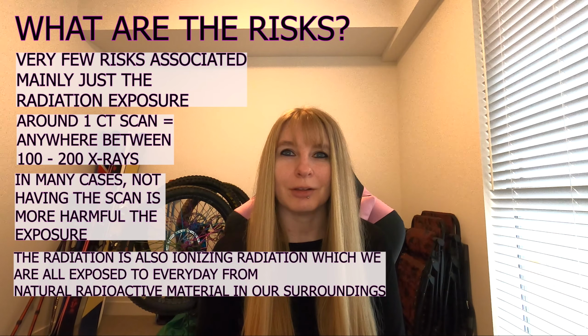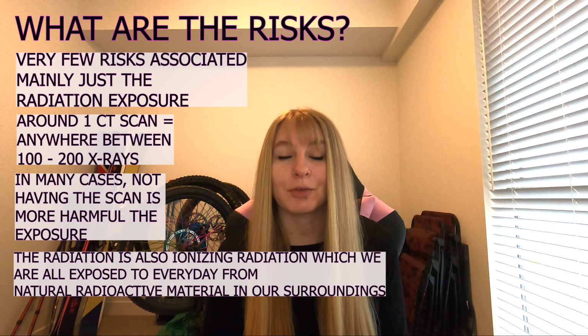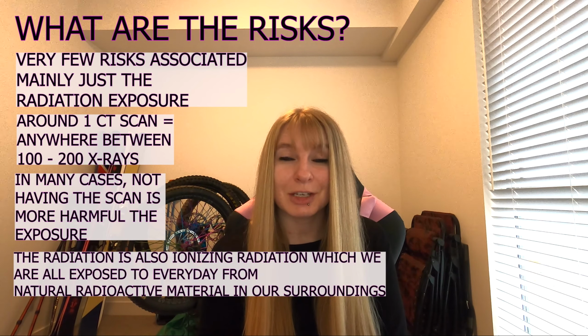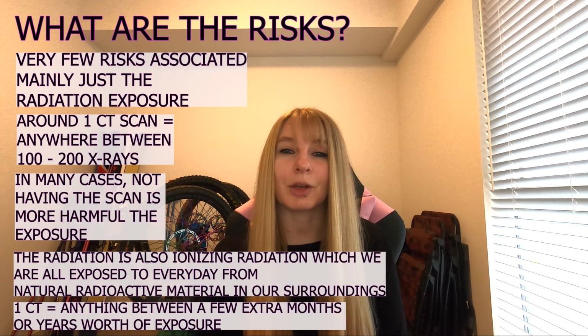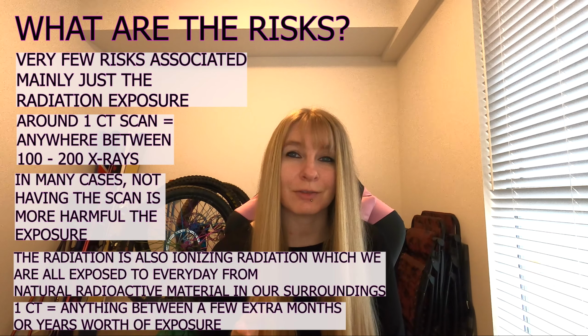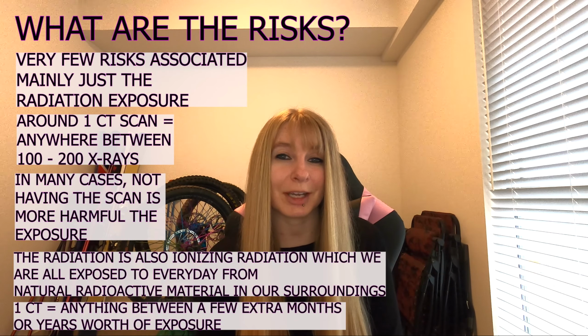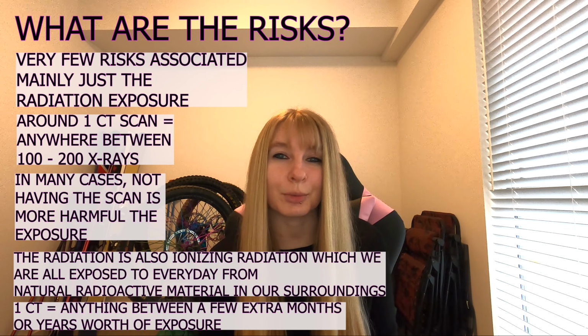The radiation as well is ionizing radiation, which we are all exposed to every single day from natural radioactive material in our surroundings. Again, one scan is said to be equivalent to anywhere between a few extra months or a few extra years of exposure to this type of natural radiation. So if your doctor thinks it's necessary to go for a scan, I would always do it.